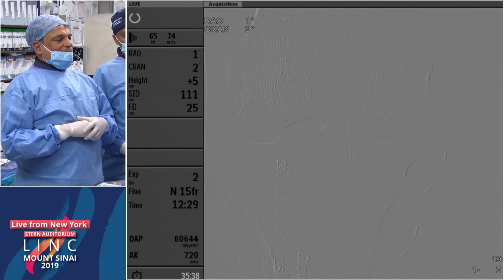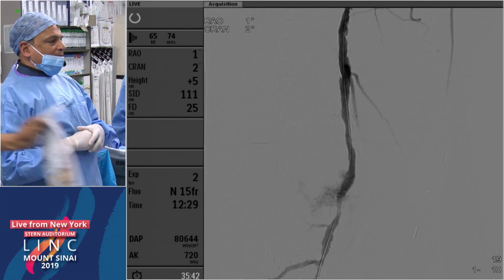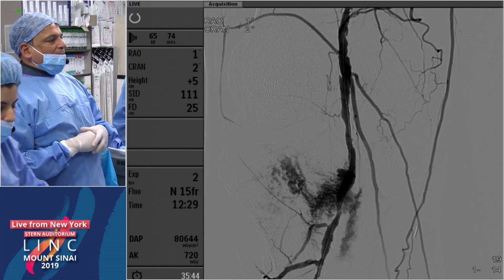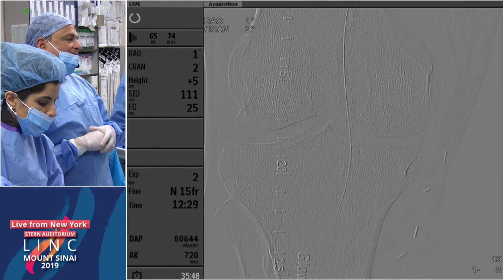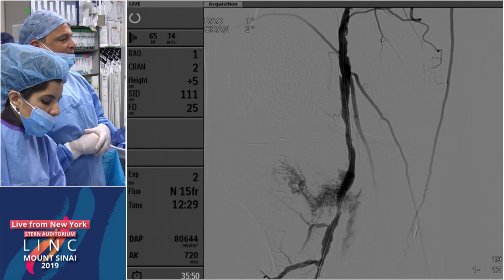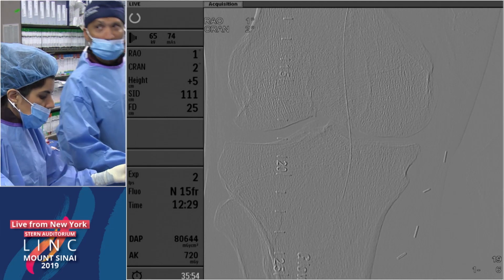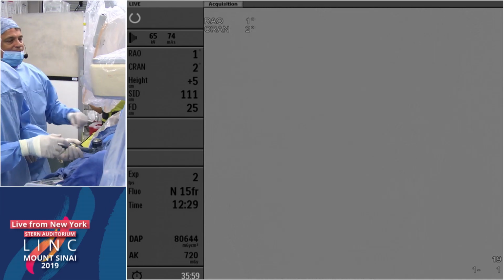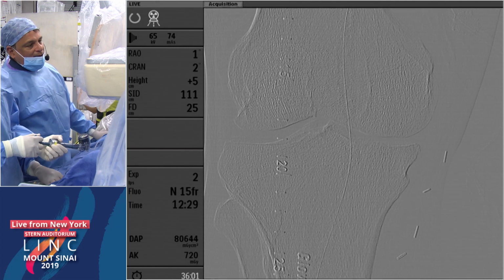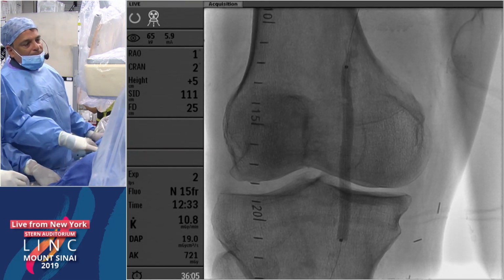So the question, Brian, is at this stage, I know one of the things to the panel, we generally will do a prolonged balloon inflation, which we're doing now. Then what are your thoughts in terms of, do you think these kind of things can turn into pseudoaneurysms in the future if we don't put a covered stent? And then obviously you're dealing with what covered stent are we going to use in this area?